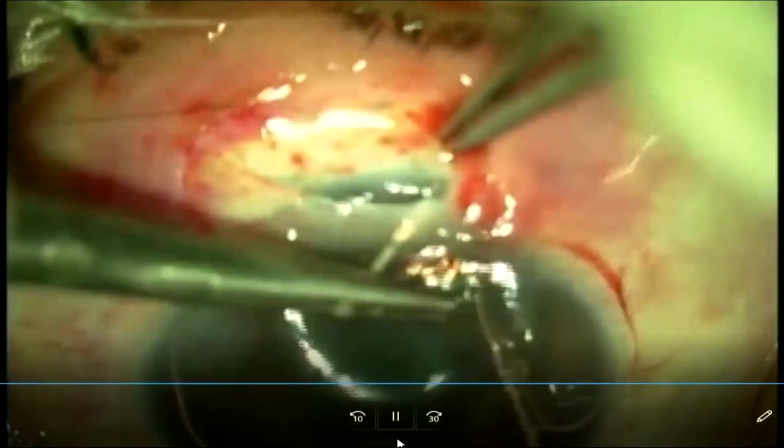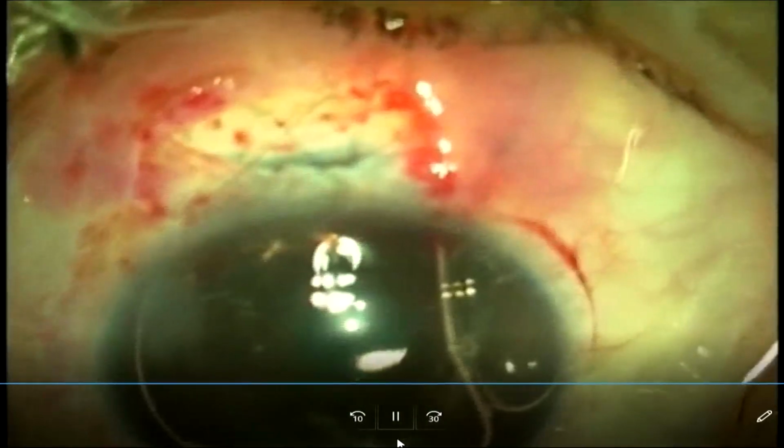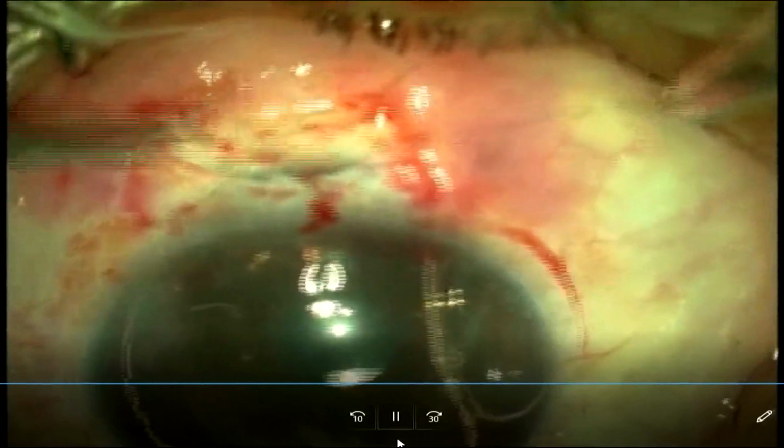So what you need to do, you should suture these kinds of tunnels wherever your wound is unhealthy. See, the superior wound is so ragged, so you need to suture these wounds. So never leave a leaky wound unsutured, because it's not about not suturing the wound, it's about giving a secure wound. That is most important.